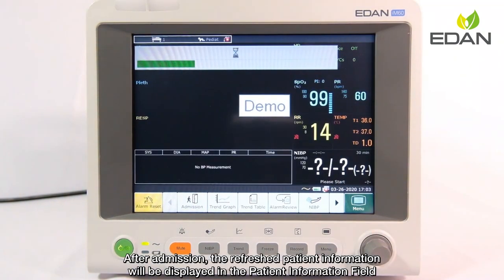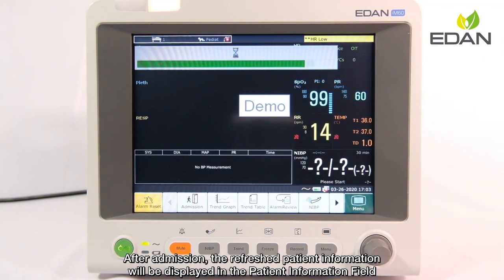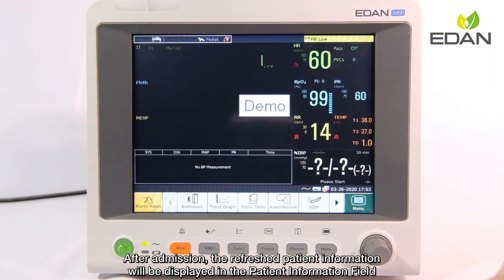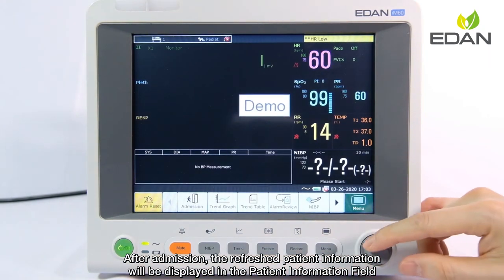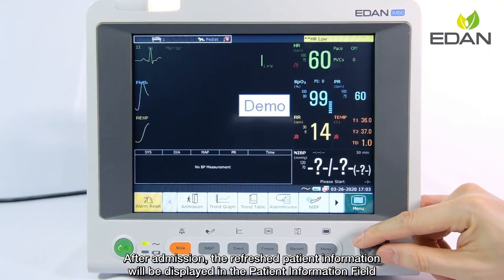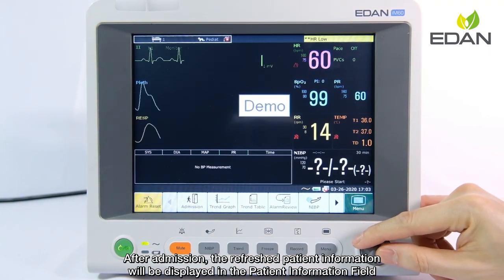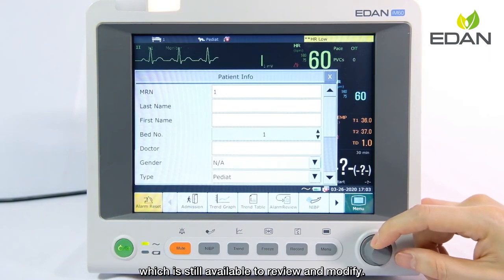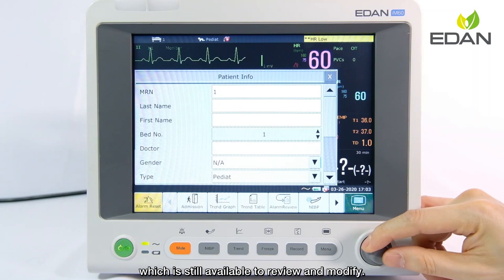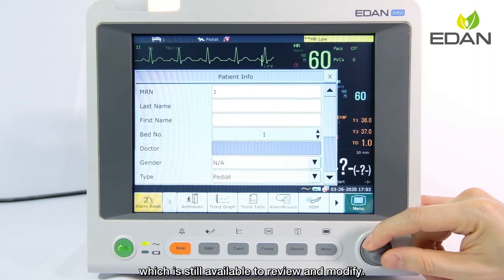After admission, the refreshed patient information will be displayed in the patient information field, which is still available to review and modify.